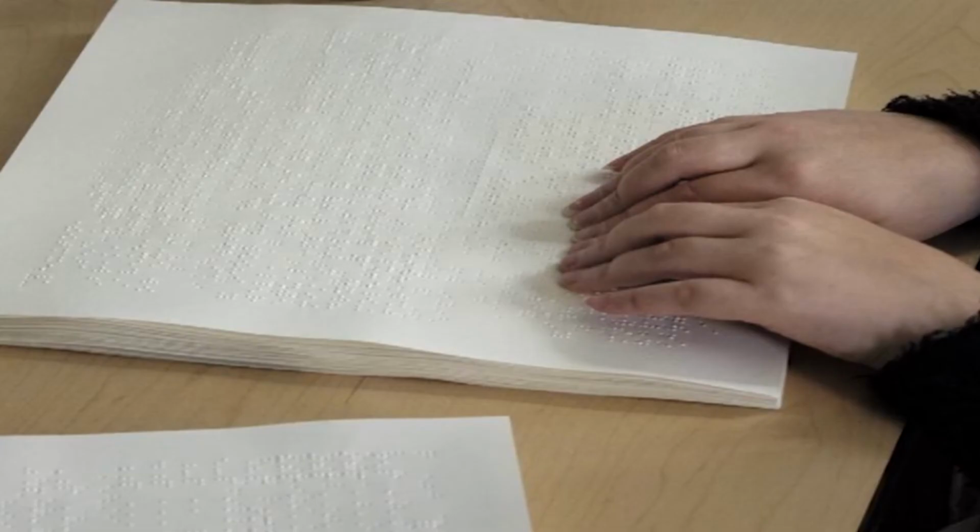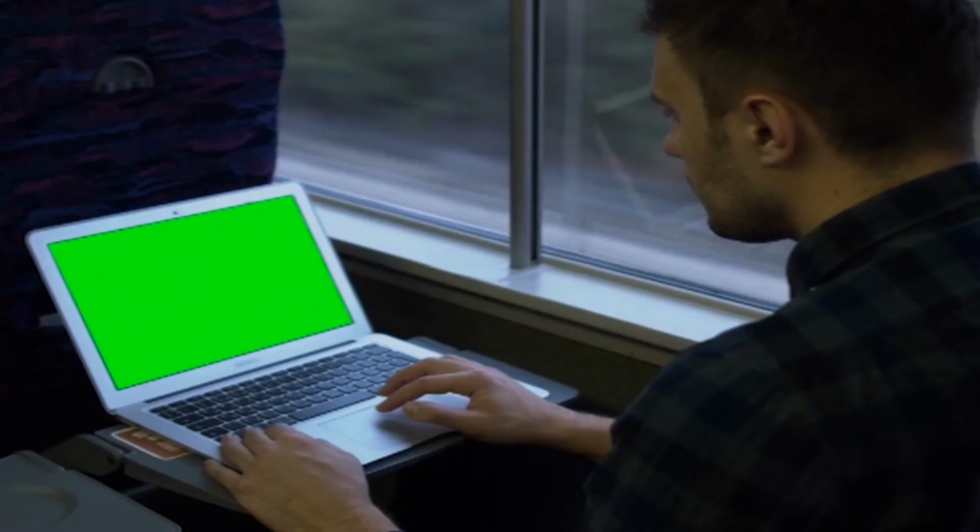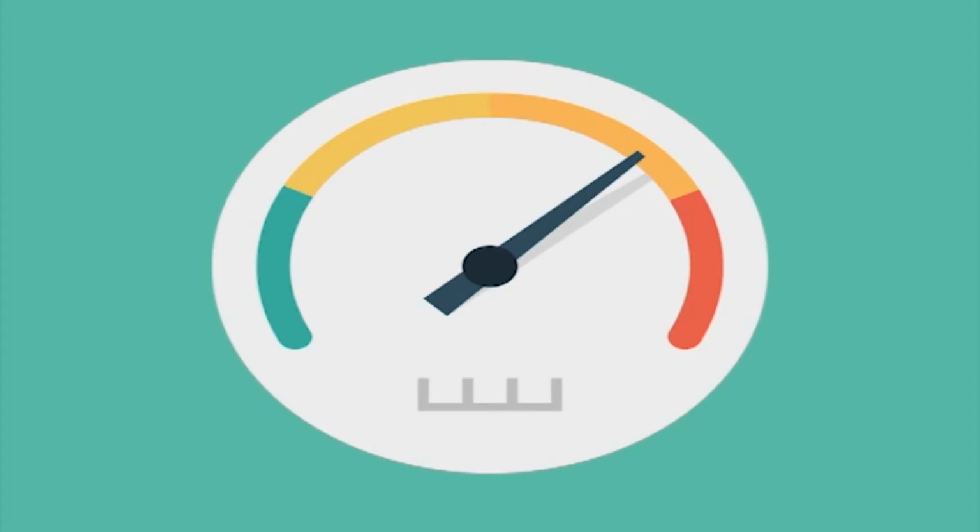Single-sided or double-sided print. Single-sided Braille embossers are ideal for occasional use. Double-sided Braille embossing reduces the number of pages and weight of finished document. This is ideal for those who carry their work around. Embossing speed measured in characters per second. This information will help you to decide, when looking at the volume of Braille you are going to produce, and how frequently you will use the embosser.